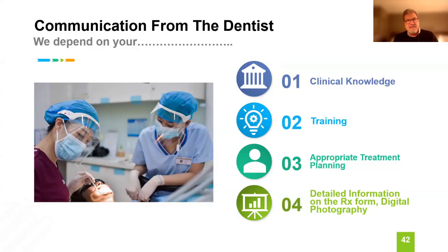Maybe tell me if there's a problem, maybe with occlusion. I've gone so far as to get little videos of how the patient goes into lateral excursion and see what kind of bite the patient has, so I can decide whether to give the patient physiological centric occlusion, lingualized occlusion, or just regular centric occlusion on these types of cases.